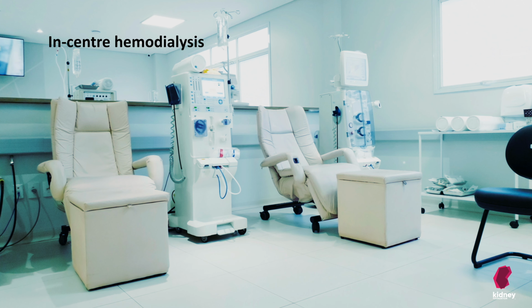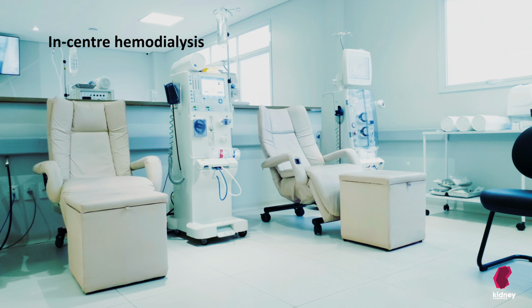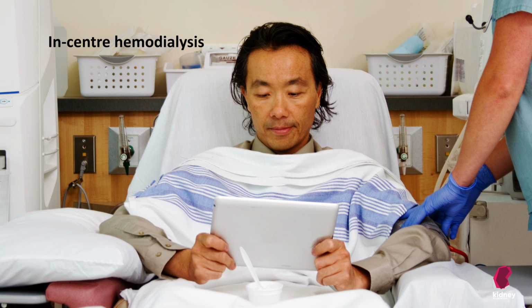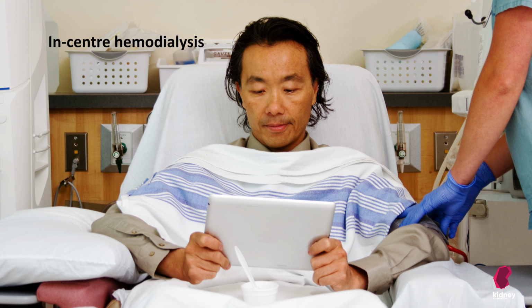In-center hemodialysis. In-center hemodialysis is done in a dialysis unit, often at the hospital or in a clinic. With in-center hemodialysis, the nurse will do the treatments for you. You usually sit in a chair and you can do activities such as reading or watching television during the treatment.